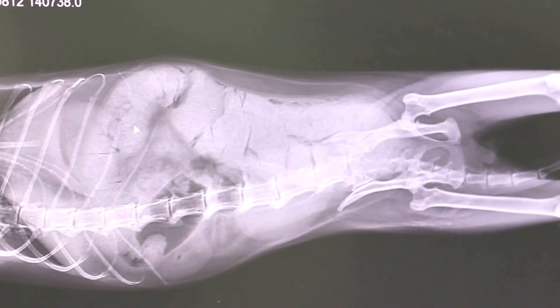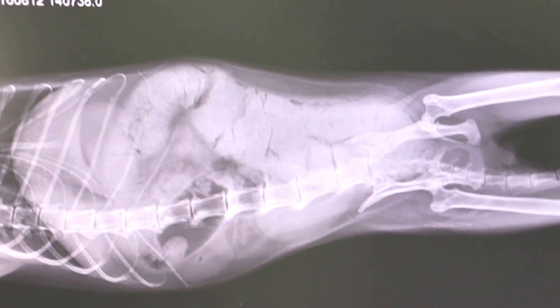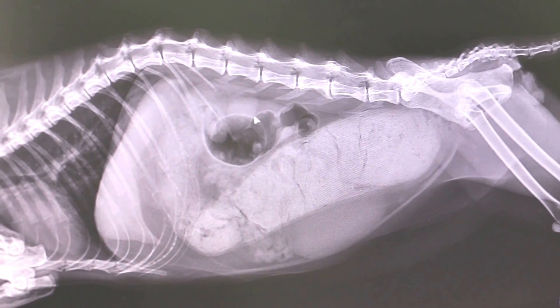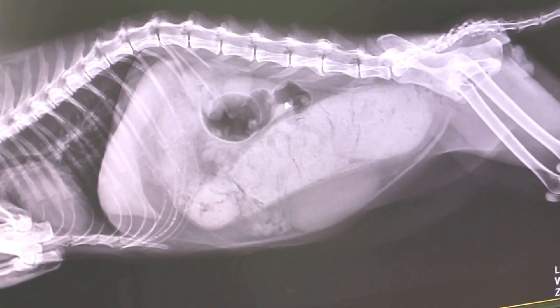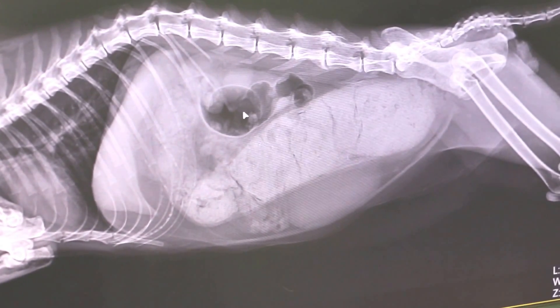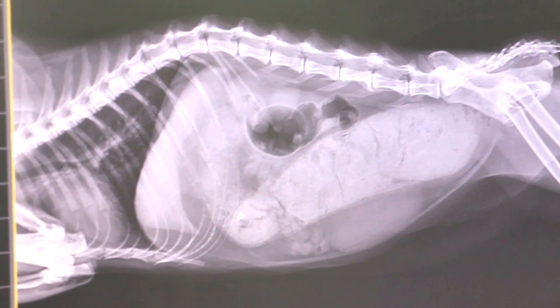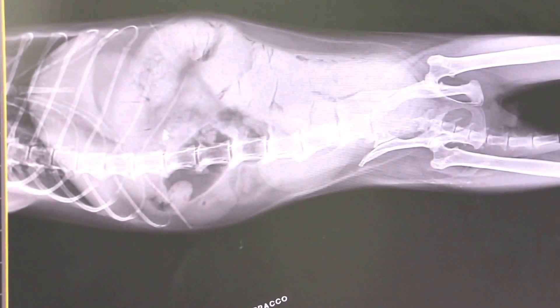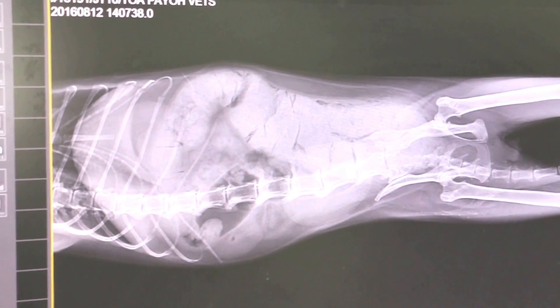The ascending colon is here, but the ascending colon has no stools so you can't see it. The descending colon and transverse colon have stools getting stuck, and as it goes further down to the rectum it becomes more and more dehydrated and hardened. On abdominal palpation it felt like the biggest sausage — and that is where the diarrhea comes in, very smelly and loose.